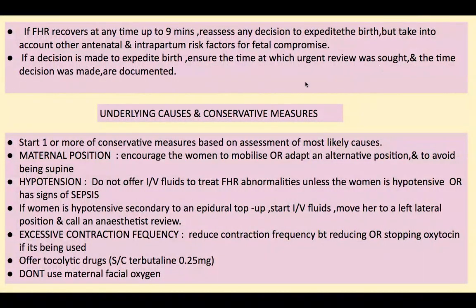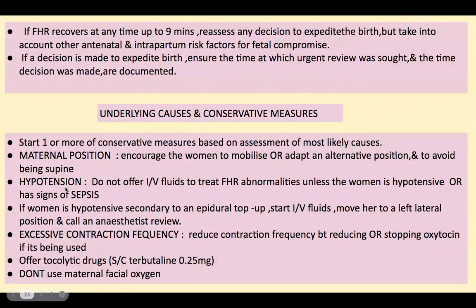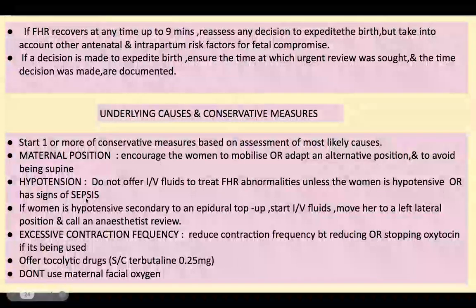Okay, all right. And you can also see the hypotension. If the patient's blood pressure is falling, do not offer IV fluid to treat fetal heart rate abnormalities unless the woman is hypotensive. It is a common practice: fetal heart rates are not fine, just start the IV fluid. It's not recommended. Do not offer IV fluid to treat the heart rate abnormality unless the woman is hypotensive or she has a sign of sepsis.